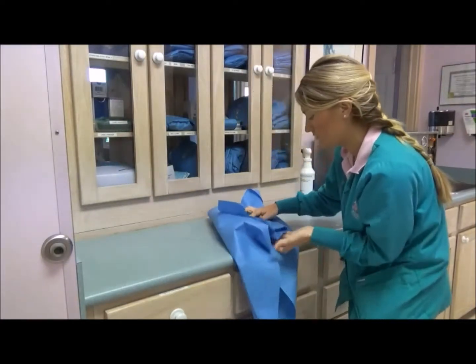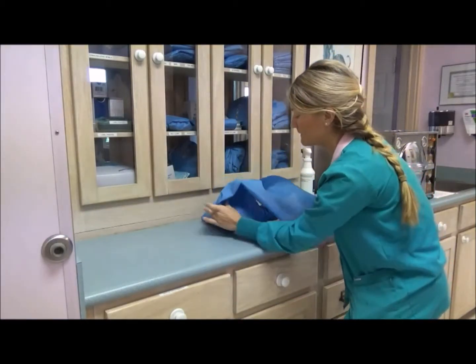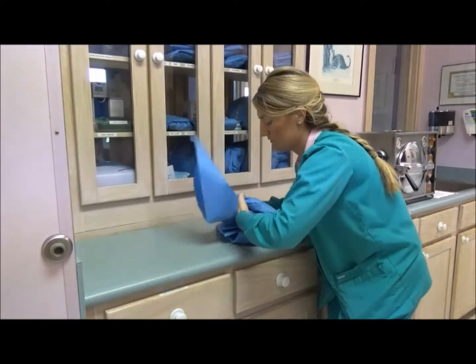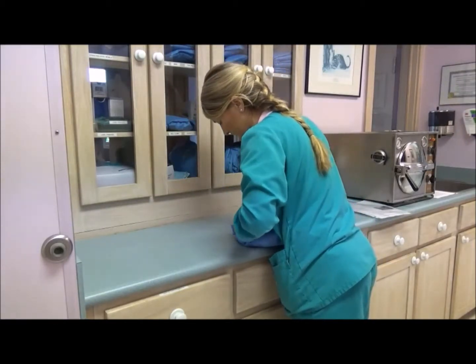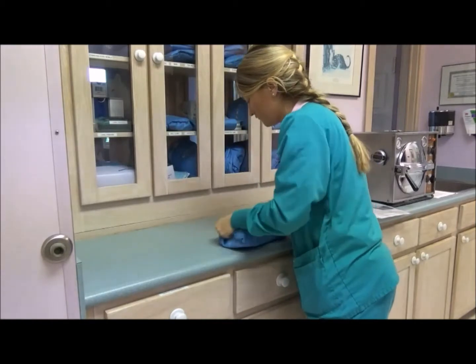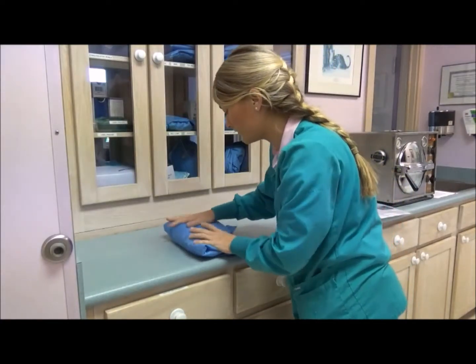And you finish off by folding this last edge. You fold the last edge into this little pocket here. And then you leave a little pull tab there, and that's how you'll start to open the pack.